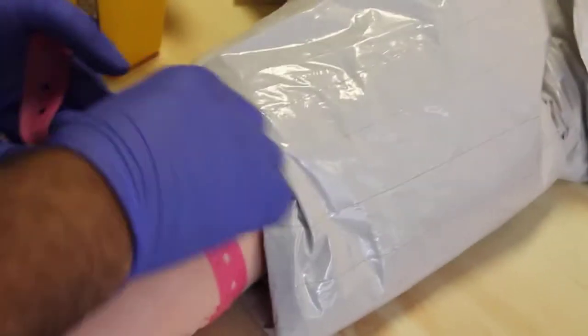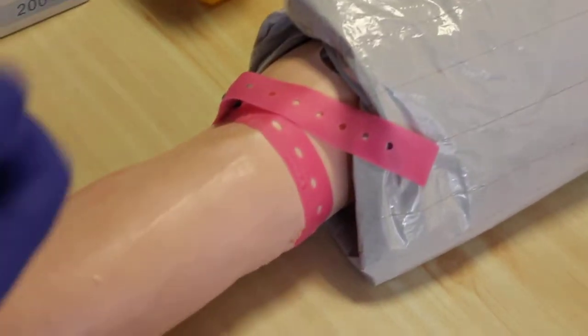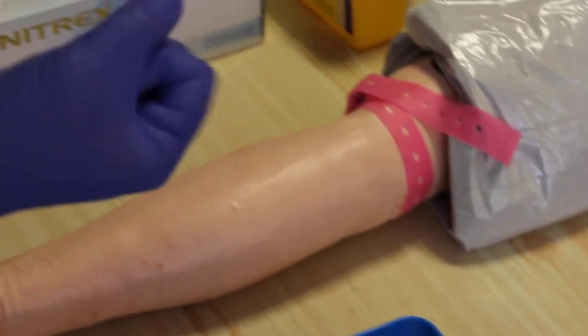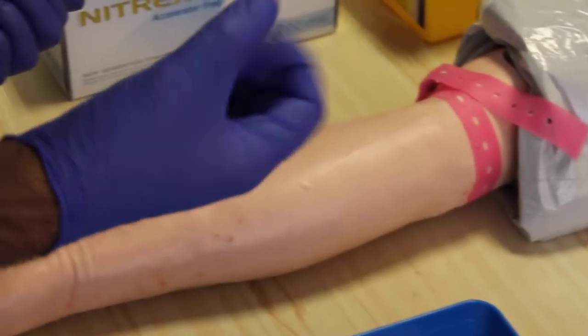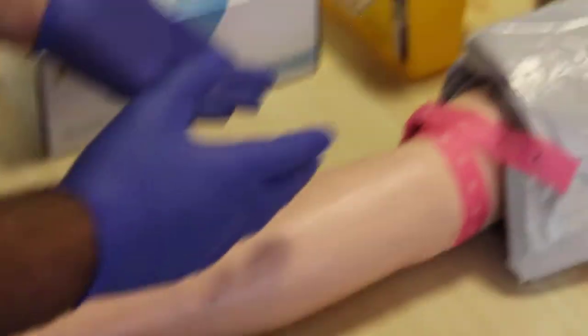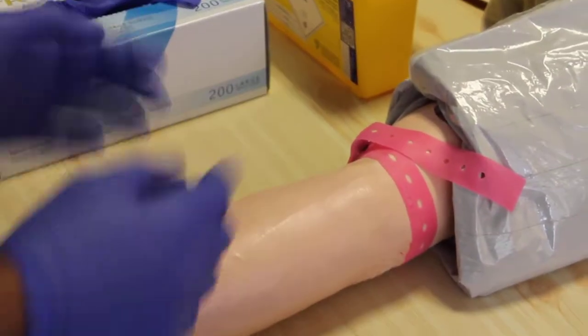You put the tourniquet around the arm of the patient. Ask them to clench their hands, close their fist a couple of times for the vein to get more prominent.